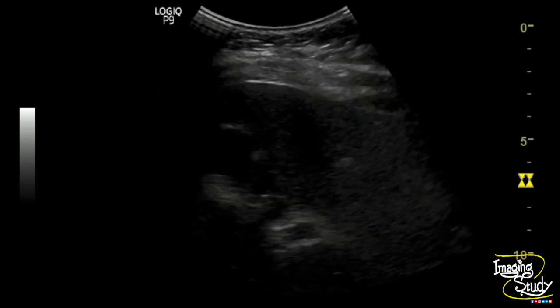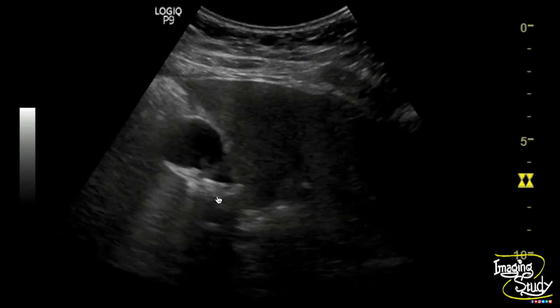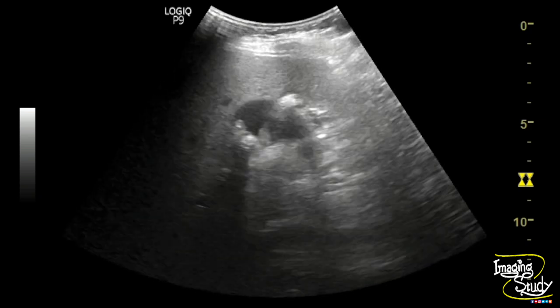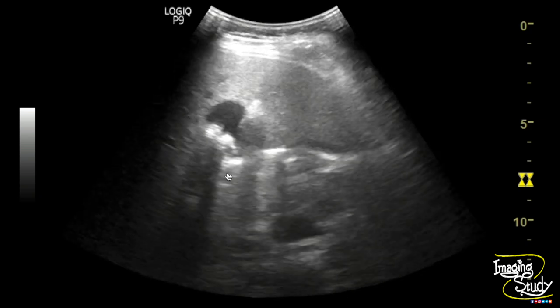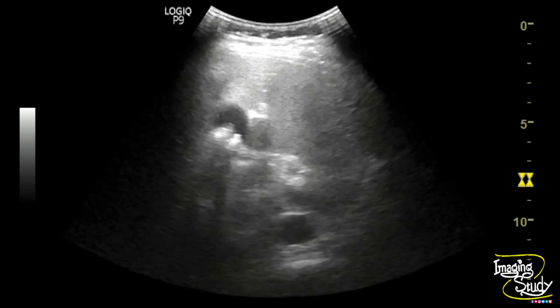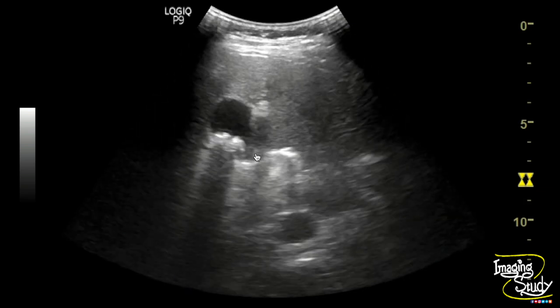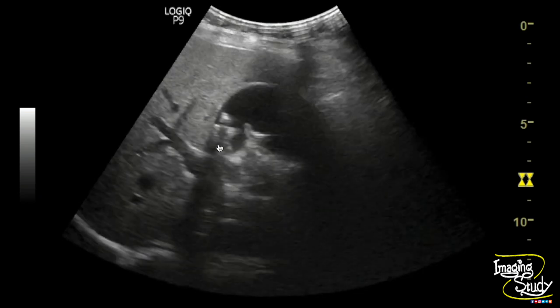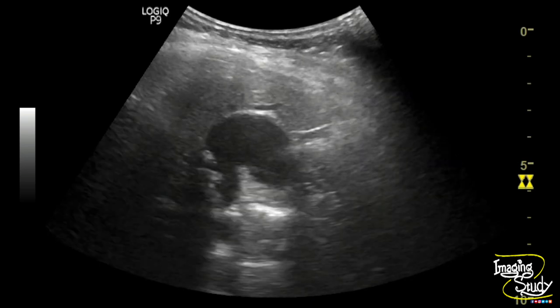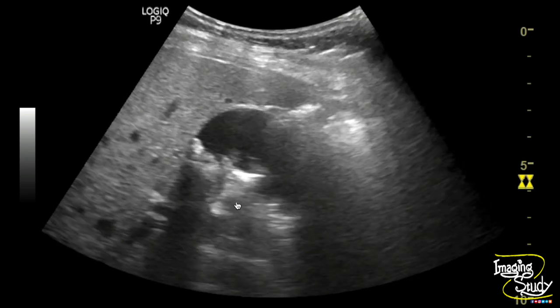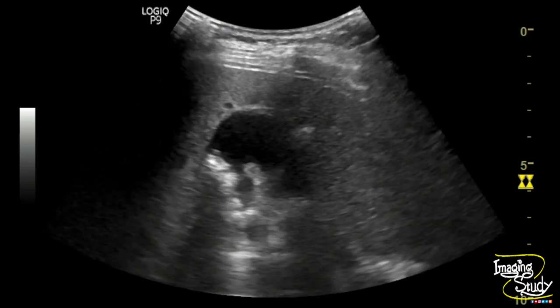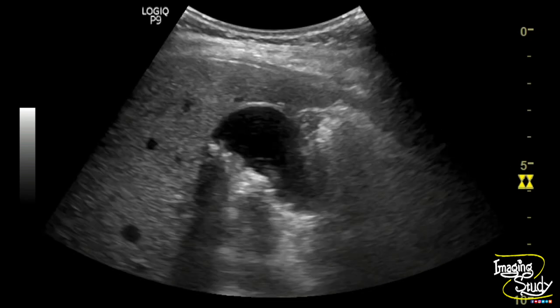Here you can see the section of the gallbladder. There are multiple hyperechoic structures casting posterior acoustic shadow noted within the gallbladder lumen. The larger one is noted at the neck region. Some of these stones move with posture changing.